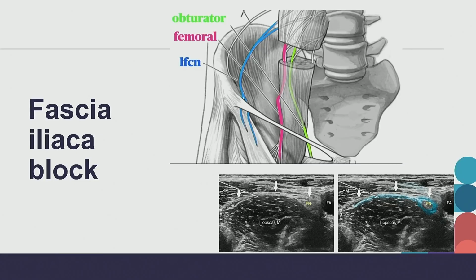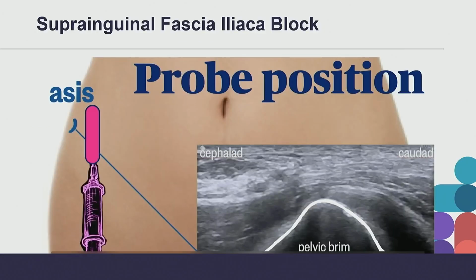So in this ultrasound image, you can see this is the classic infrainguinal approach where you're scanning just within the inguinal crease itself in a transverse view. You can see the femoral artery here, the femoral nerve just lies lateral to that, and then the fascia iliaca runs this way and joins the epimysium of the iliopsoas down this way. And so that femoral nerve is within or underneath that fascia iliaca, sandwiched between that fascia as well as the iliopsoas muscle. And so our target would be way out here between the iliopsoas muscle and the sartorius muscle. So that was the infrainguinal approach.